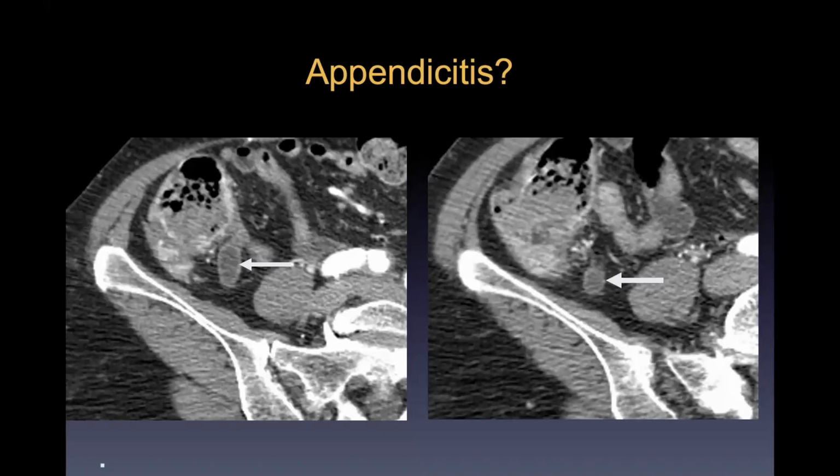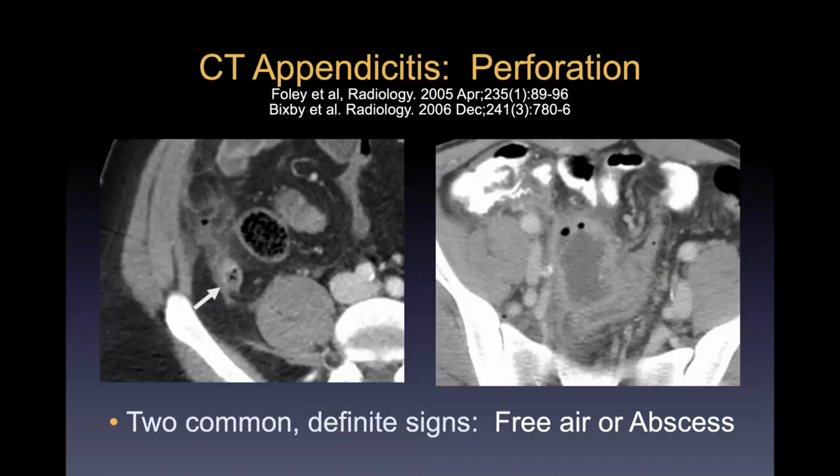But in these rare circumstances where this occurs, I think that we need to either follow up with the patient, if the patient is still there on the scanner at the time you're reading the scan, just to find out if they're symptomatic, or if the patient is gone, to get in touch with the referring clinician just to make sure that somebody checks in with the patient and that they don't have symptoms that could suggest this diagnosis. It's just an unusual appearance in normal patients.